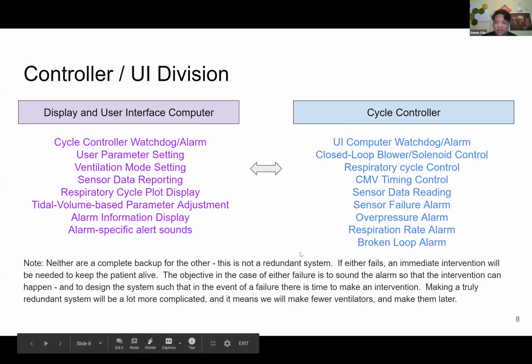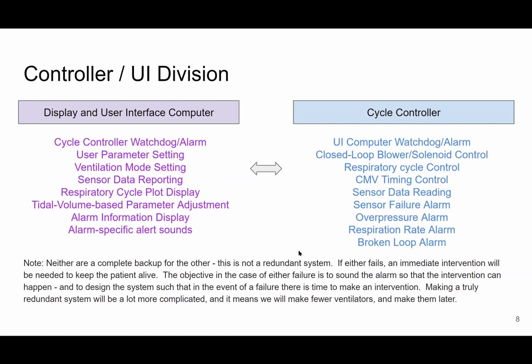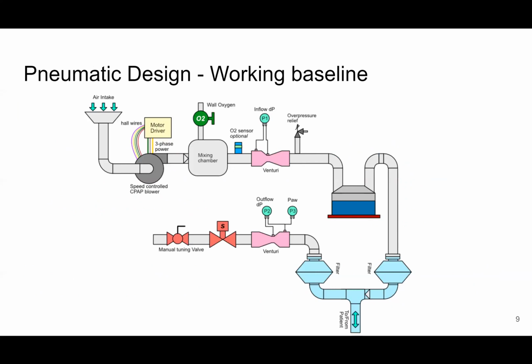Most medical ventilators in use in hospitals do not have full fault tolerance redundancy. I have a question about Derek Yerger here. For the controller, is it not possible to have it still do the activities of controlling the electronics and doing some sensing? If there were a failure in the Raspberry Pi, there would be some data collection and reporting back to the user would be gone, but it would still be able to serve in a capacity of making sure the patient is being ventilated.